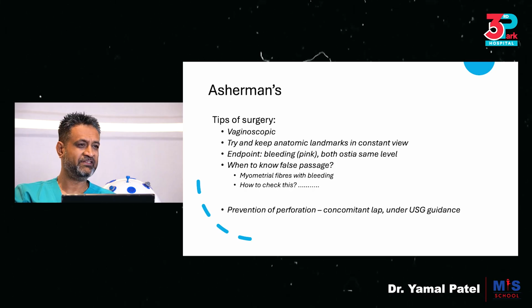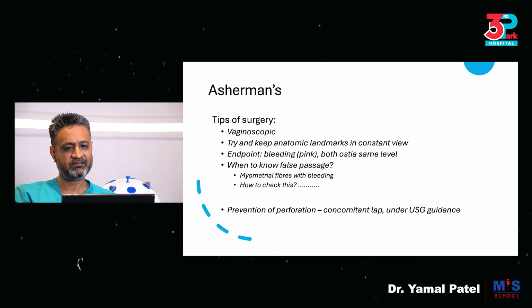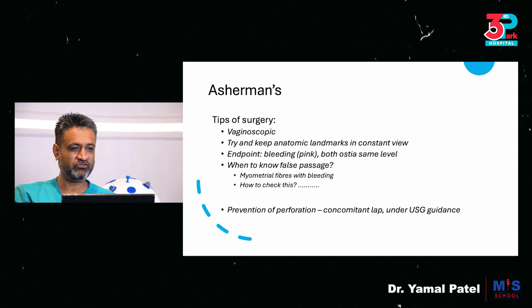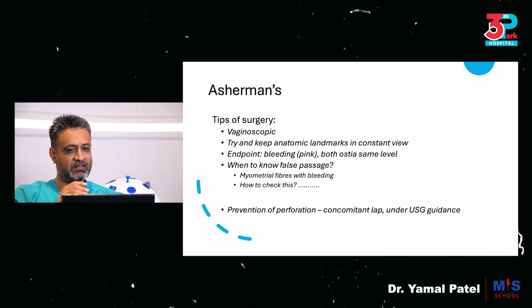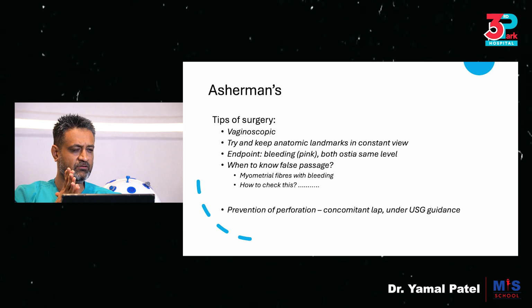Tips of surgery from my side: go in vaginoscopic, don't forcefully dilate, dilate under vision, enter under vision, cut the synechia under vision. Most of the synechia, if they are adhesion bands, would not have very high vascularity, but as you get towards the walls, you may get vascularity channels with it. Try and keep anatomical landmarks always in constant view.